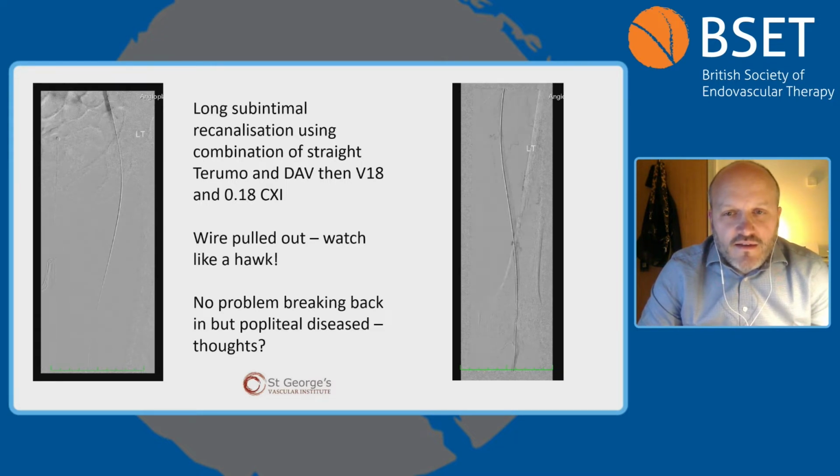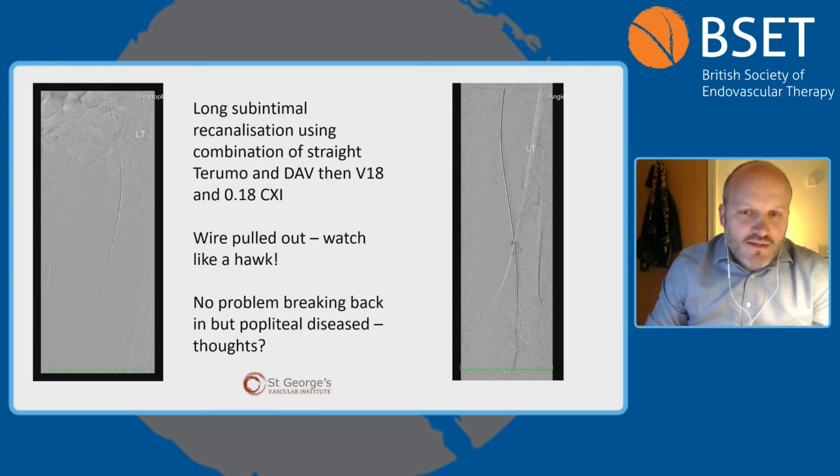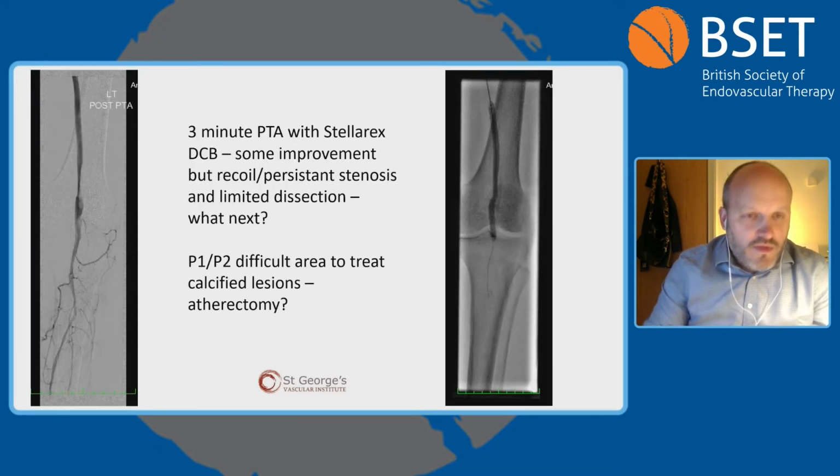So there's calcification and stenosis. So my thoughts at this stage are, it doesn't appear to be flow limiting. Do we leave it? But we've got a long subintimal tract that's a high risk of reoccluding. We decided to treat it.